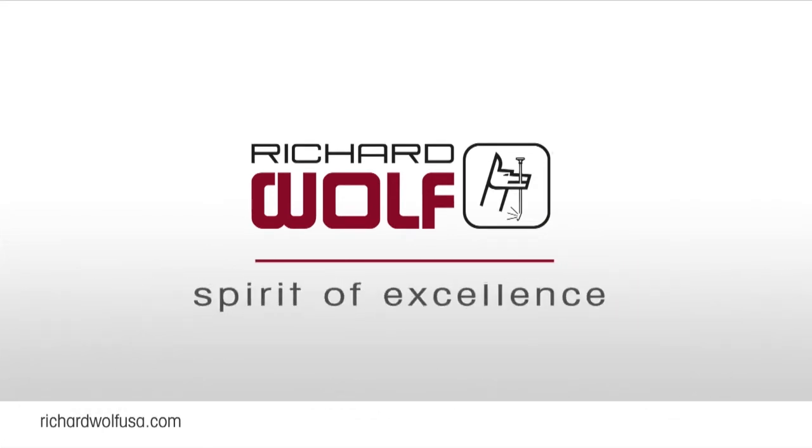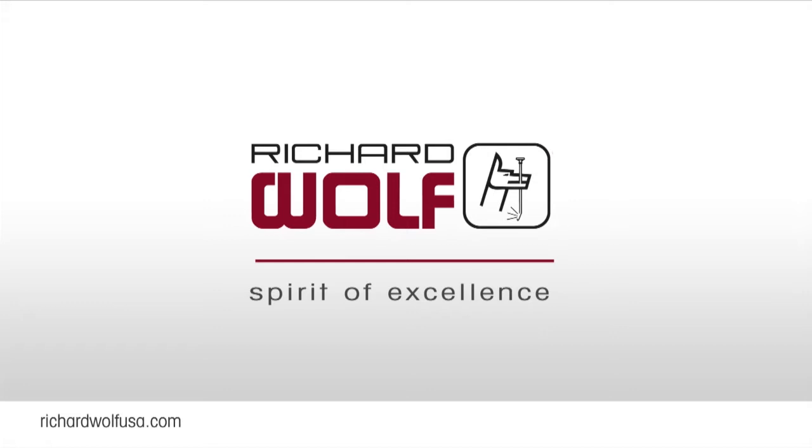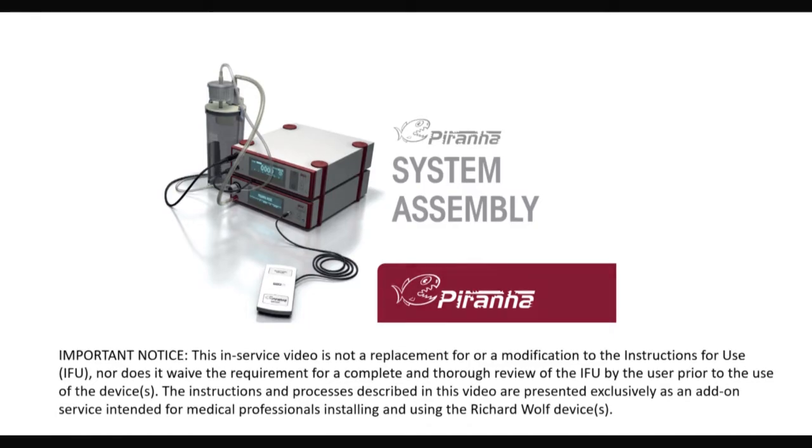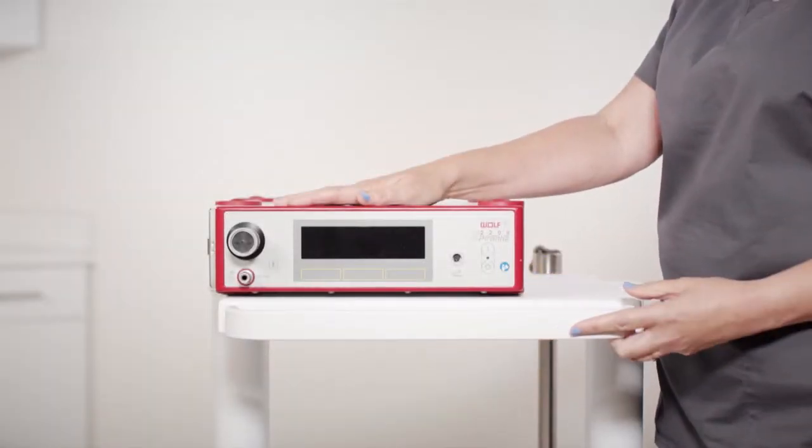Richard Wolff Spirit of Excellence. Here we're using the Richard Wolff Mobile Mini Cart.